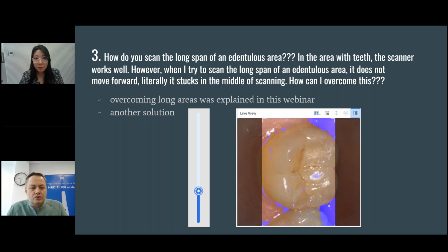Now you are going to start from the teeth, go to the end of the crest by doing a slight angulation from vestibular to palatal. And in this way, you're going to have a very fast scan of the fixed tissues, and also getting them in a green reliability mode, because the cloud points are validated by your slight movement of the tip.